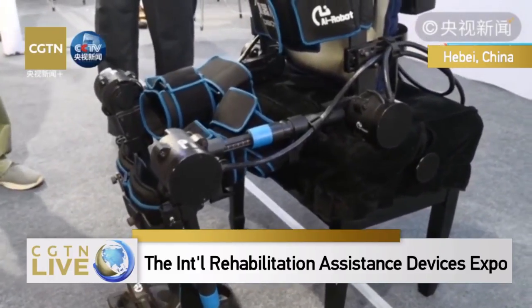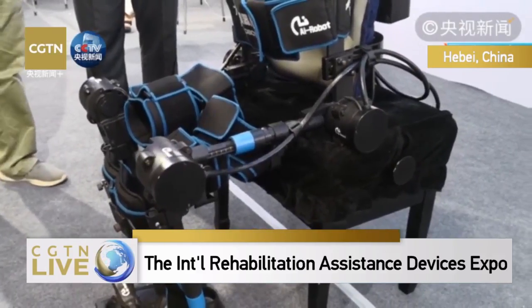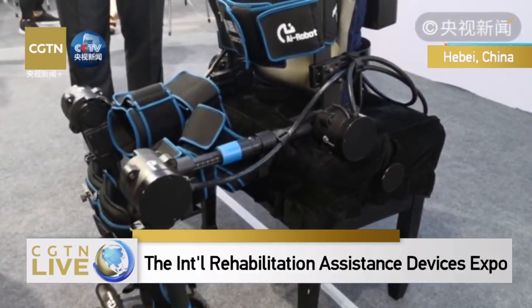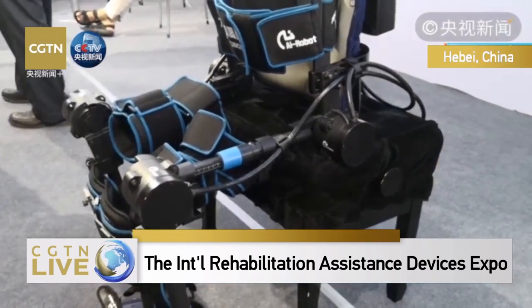Can you give us a demonstration? We want to see how this works.